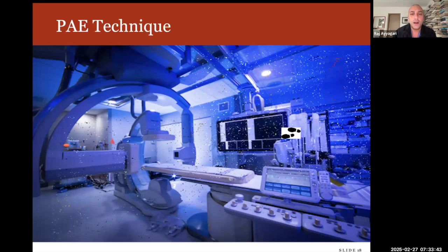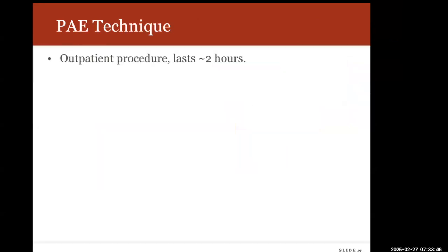with embolization. Do you have any cutoff for if someone's had a catheter for years, where you then say, no? I mean, then I might suspect that the bladder is not working well anymore. And so that's when you might get a urodynamic study to do a good evaluation of bladder function. Because if the bladder is just stretched and big and not going to work anymore, then it's not worth doing. But in the setting of not having a urodynamic study, it's hard to figure that out. So what I tell people is that the procedure is so easy to do and low risk that even if we don't think there's much chance of success, usually it's worth a try anyway, and just make clear that it's a little bit harder to predict.